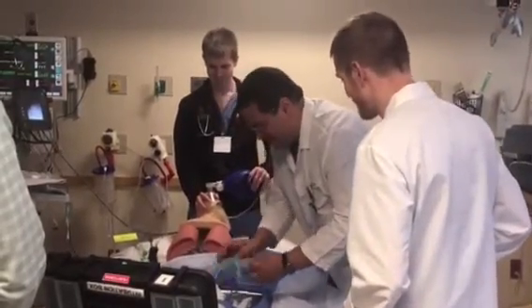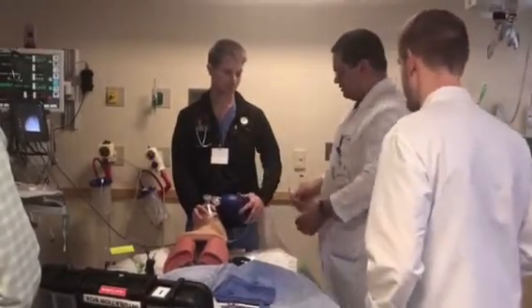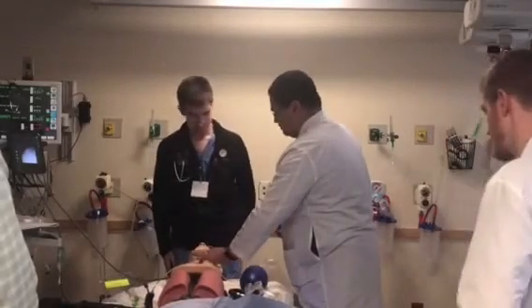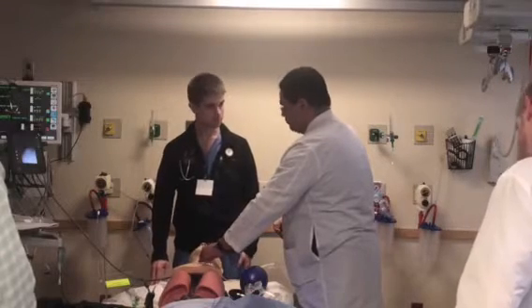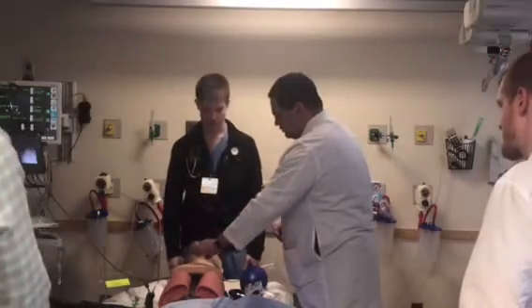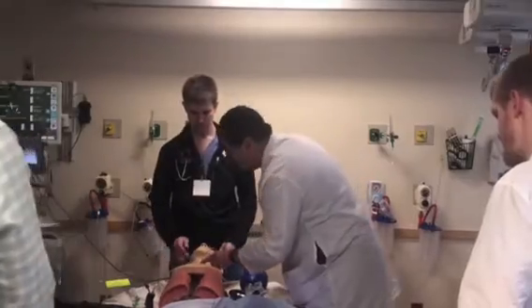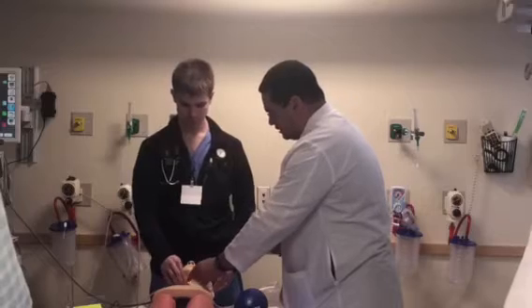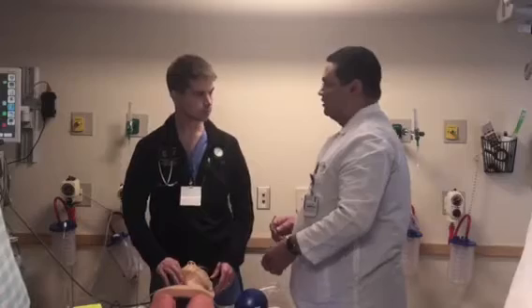It's actually wrong. Let me just say what they say in the video. What they say is: determine the cricothyroid membrane, and then cut like this. Why cut like this? So that you don't hit the nerve or the venous plexus. Well, you can cut it small, but the reason they cut it is so you can see the cricothyroid membrane. If you don't know exactly where it is, you cut like this and feel with your hand or look with your eyes to find the cricothyroid membrane.